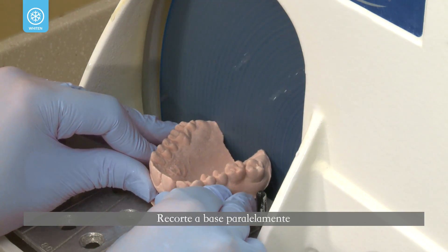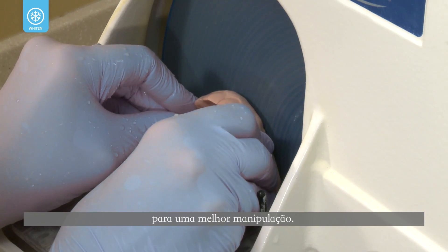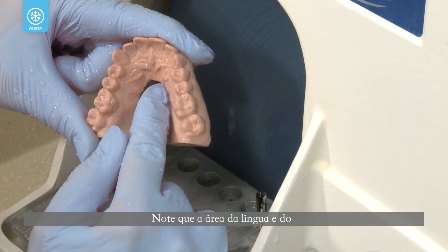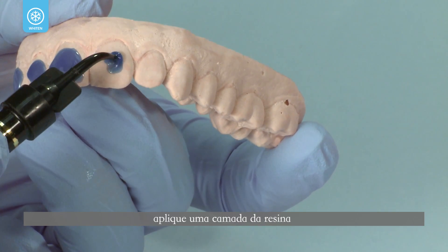Trim the base of the cast parallel to the occlusal table plate on a model trimmer to within a few millimeters of the gingival margin for ease of manipulation. Note that the palate and tongue areas are removed.